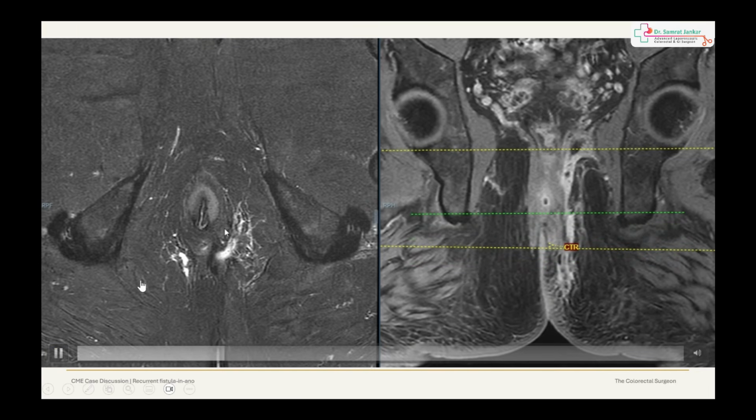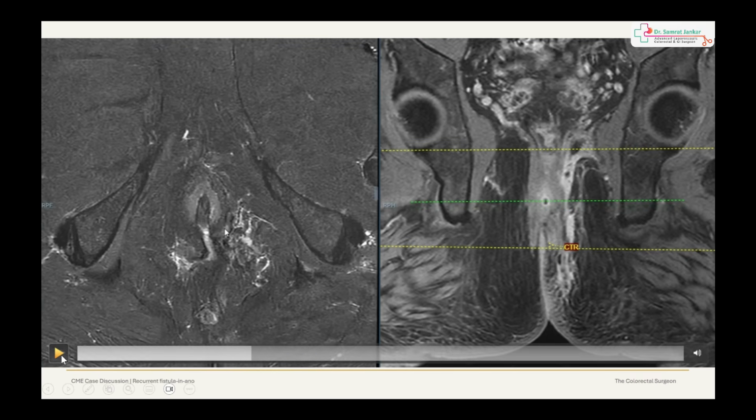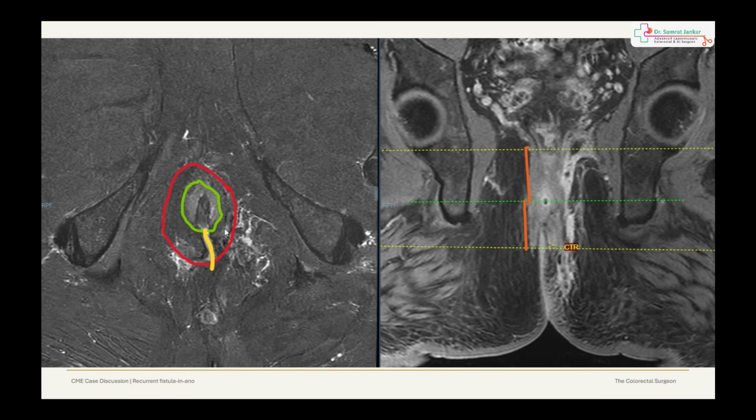This disease we can see here, which is ascending above, and we can appreciate that this bilateral ischioanal outside the external sphincter is coming and inserting at 6 o'clock, and that sees the internal opening. The internal opening here, and the internal opening is joining here. This is the internal sphincter, this is the external sphincter, and if we see the internal opening green at the mid, it means it is more than 30%. Obviously this is a high transsphincteric tract, so we need to think that the crossing is there at the high transsphincteric level, which means it needs a sphincter preserving procedure.